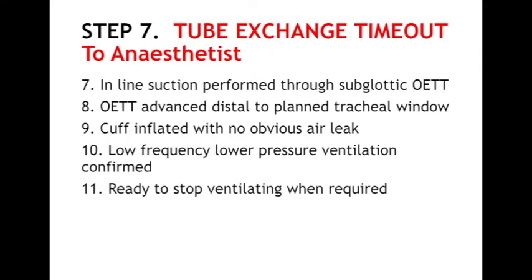The second part of the tube exchange timeout is addressed to the anaesthetist, confirming that inline suction has been performed through the subglottic port of the oral endotracheal tube and any secretions above the cuff have been cleared. It is confirmed that the oral endotracheal tube cuff has already been advanced distal to the planned tracheal window.